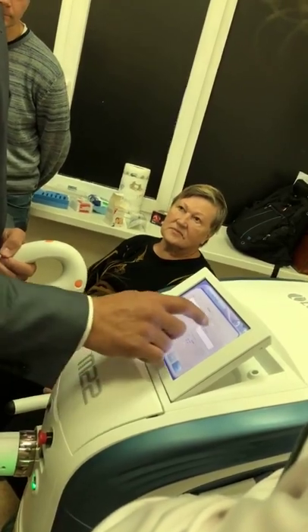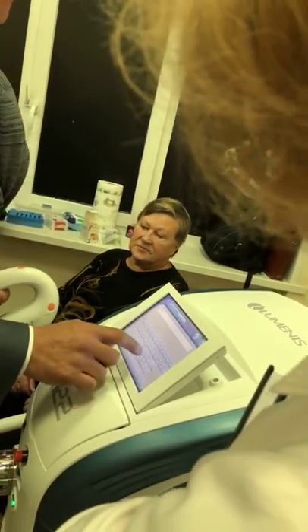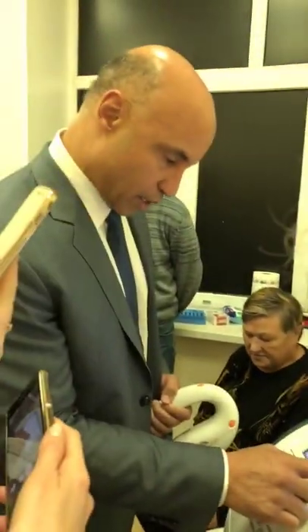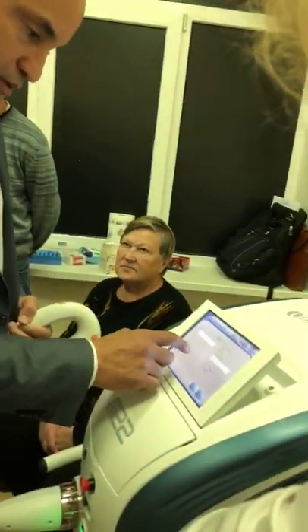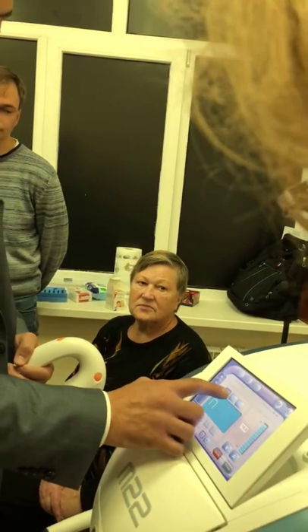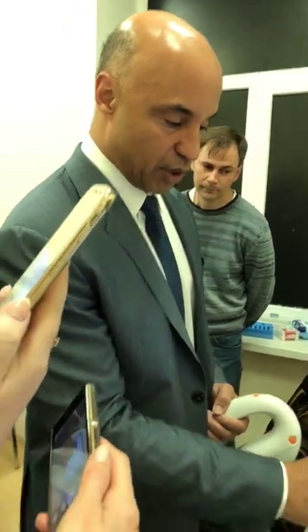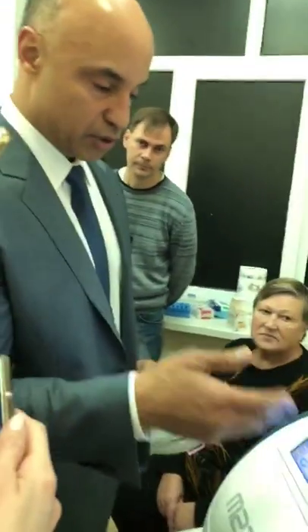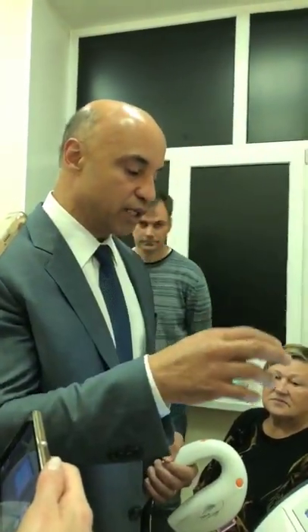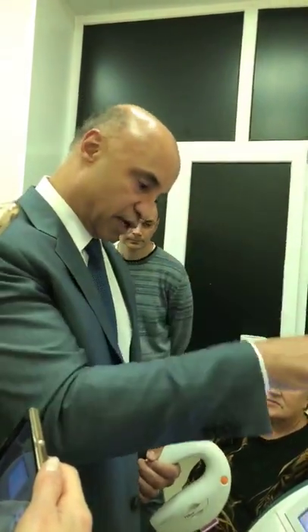New. Toyos IPL. Check. Let's cancel that. All right, so here's one pulse, two pulses, three. So this is going to be a triple pulse. So with our parameters, what we want to do is go triple pulse. So instead of giving all the energy to that thin skin of the lid margin all at once, what we want to do is pulse it. So it's on, off, on, off, on.